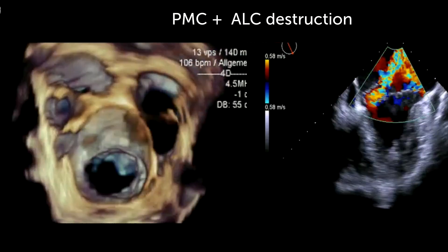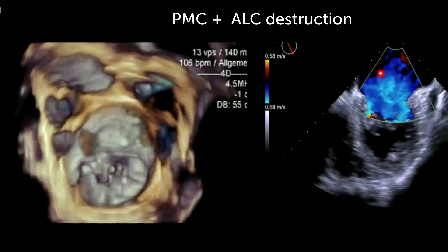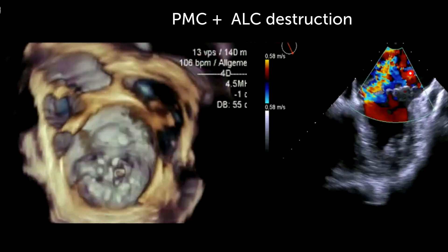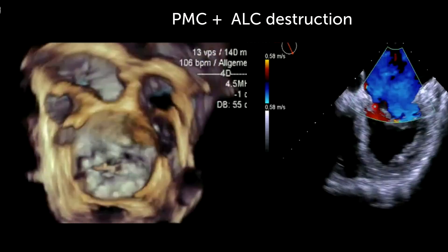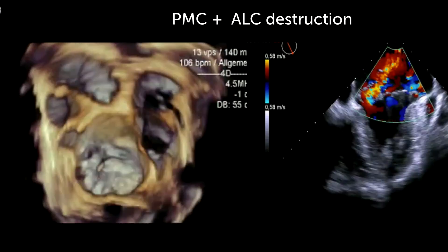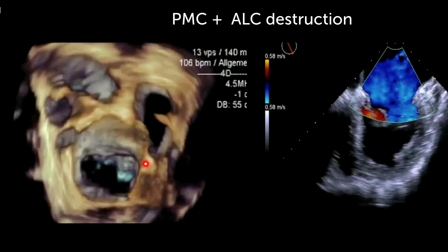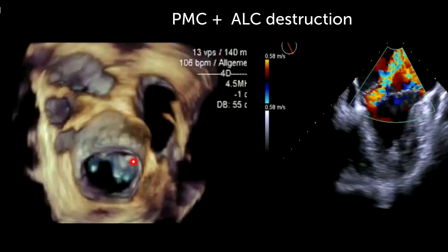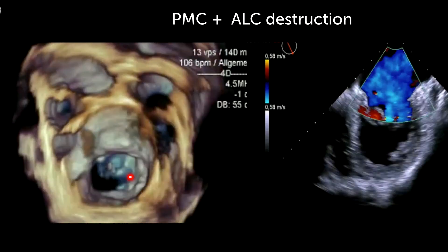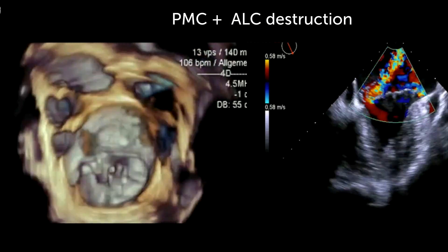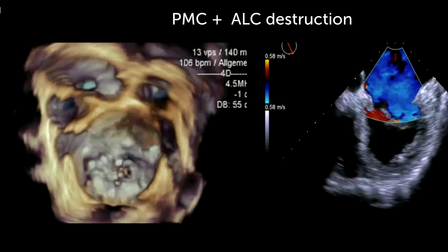A patient who has a jet coming from the posterior medial commissure, right here, and another jet is coming from here. This patient had endocarditis in their history. This is the corresponding 3D image. Look how nicely you can see the destructed posterior medial commissure here, and also the anterior lateral commissure. There's probably some rupture or torn cordia or torn leaflets right here, which explain the jet very nicely — a nice way of displaying the problem.